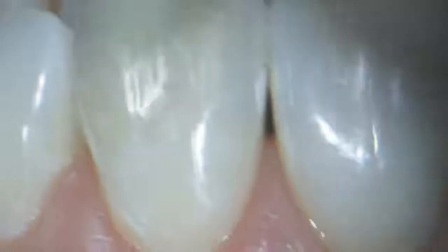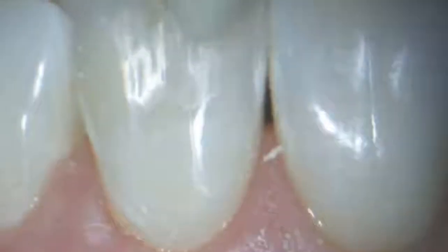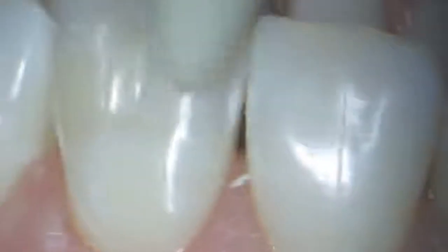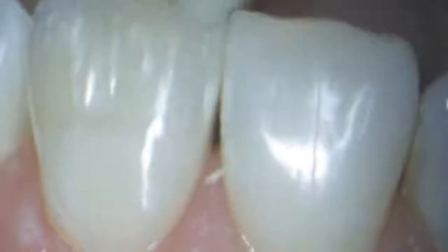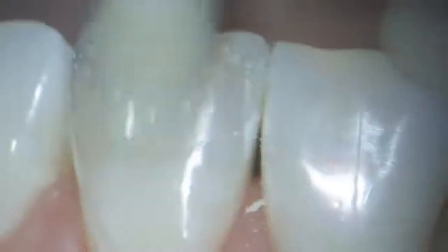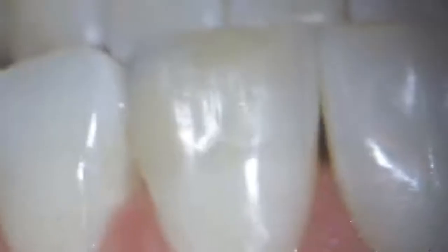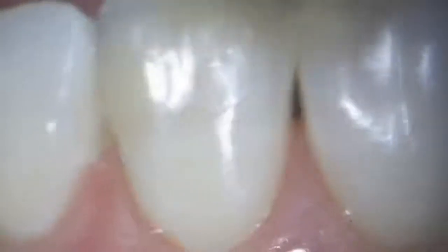This polisher affects the surface of the composite very volumetrically and gives us quite a good preliminary gloss. The next tool for polishing is a brush made of goat bristles, Ghost Shiny, from Microbrush company.